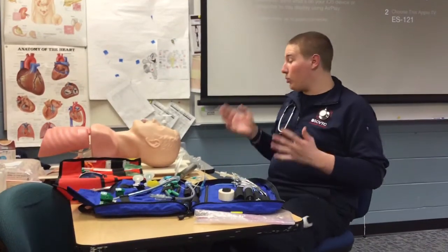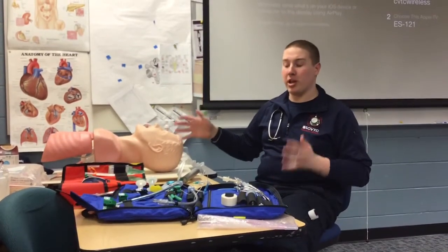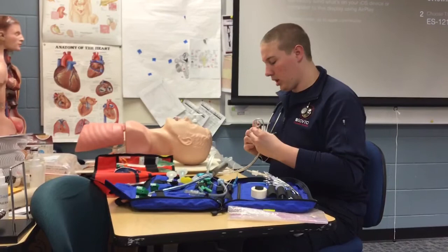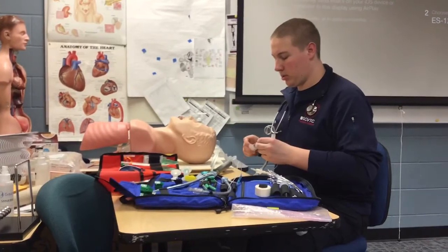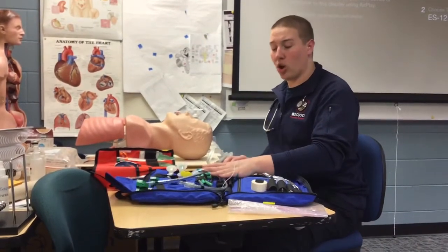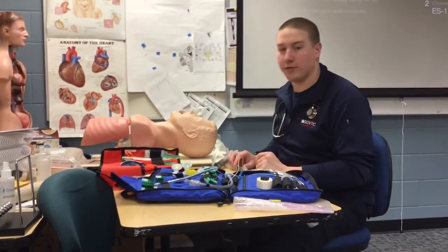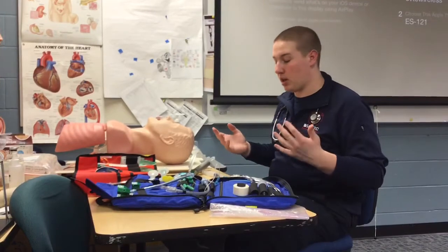So to start out with, I would have a partner. They would be using a BVM attached to high flow O2, and they would be pre-oxygenating the patient as I prepare my equipment. So I'd select the appropriate tube size. I would check the balloon, make sure it holds air. I would leave the syringe attached for now. I would also have a tube size above, a tube size below, just in case the tube size I grabbed doesn't work. I also have backup airways here in case the intubation fails. And then both me and my partner would have on the appropriate PPE for this procedure.